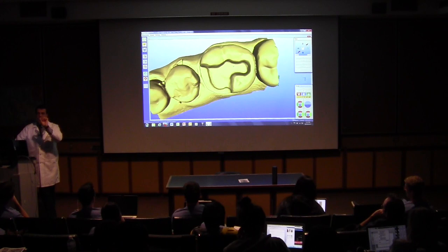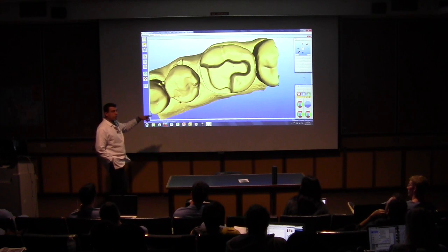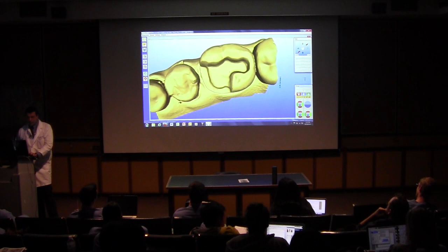All right? Particularly, this is project number 11. This is tooth number 30, and we're supposed to do an MOL prep here. Same situation. Patient came to the clinic, had a mesial occlusal restoration done a long time ago. This was all composite filling. And the mesial lingual cusp ended up being fractured because this was a large preparation. So removing the previous filling here, we decide to do the onlay prep.